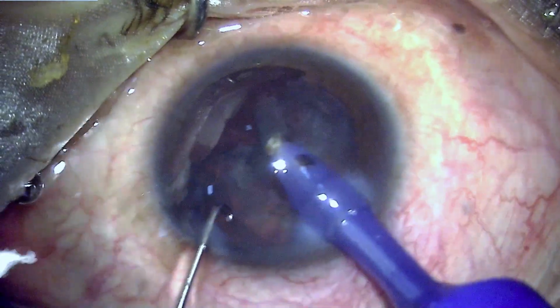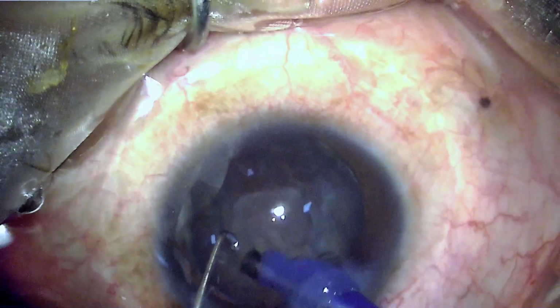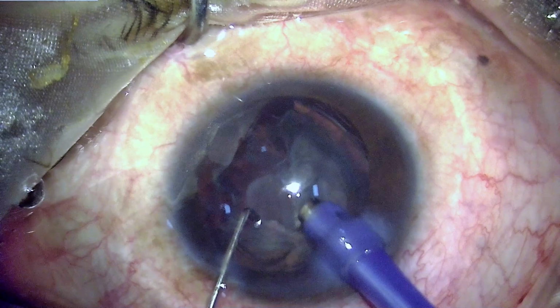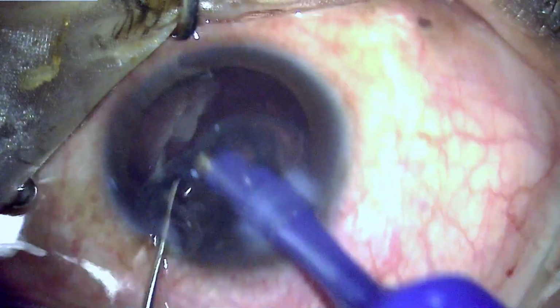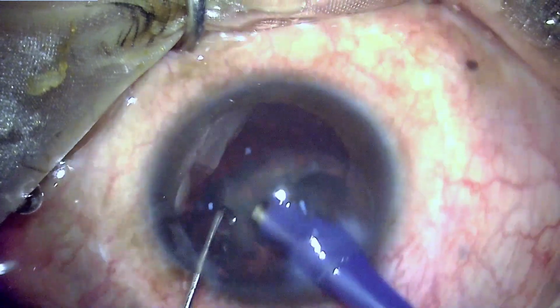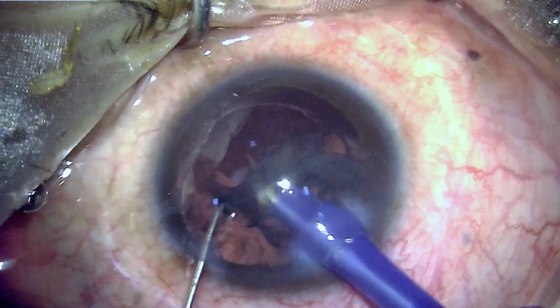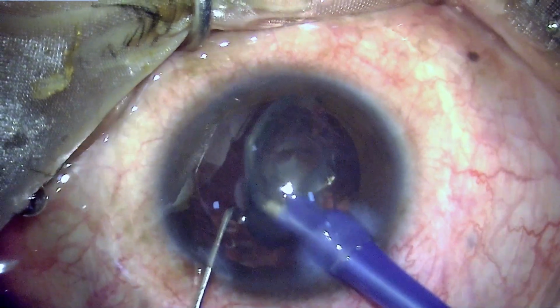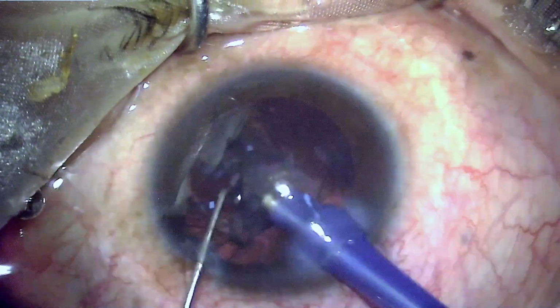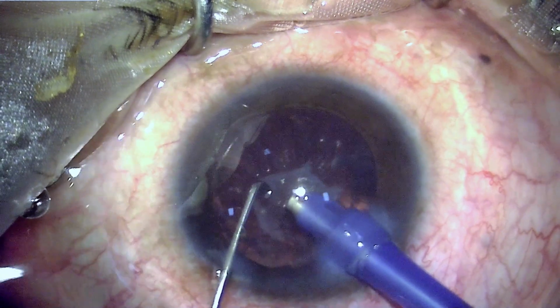So this is the epinucleus which is being removed. It's always good to remove the epinucleus using the phaco handpiece because the epinucleus is a little bulky and the phaco handpiece has a greater flow of fluid. So it's convenient, fast and easy to remove this epinucleus through a phaco handpiece rather than the irrigation aspiration handpiece, which has a very small port. We can appreciate the posterior capsule, which is shimmering because of the presence of oil behind it.